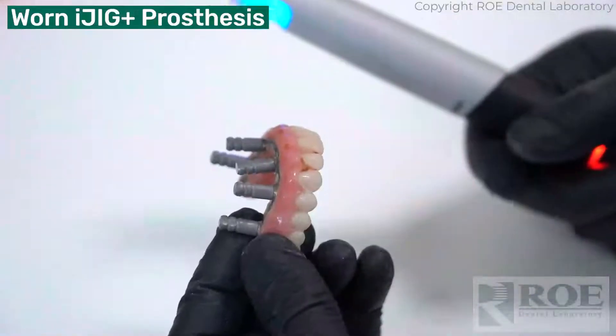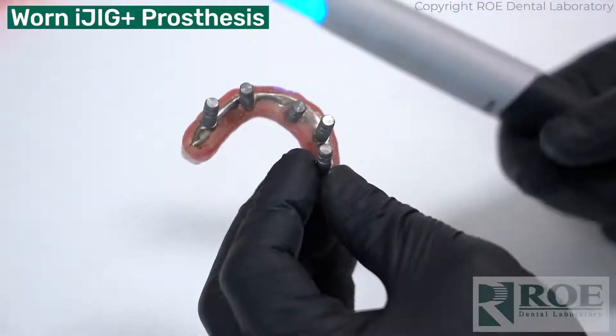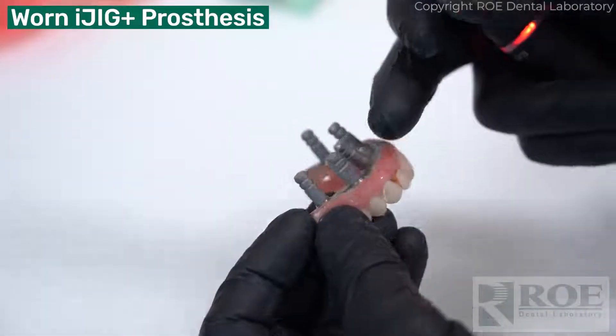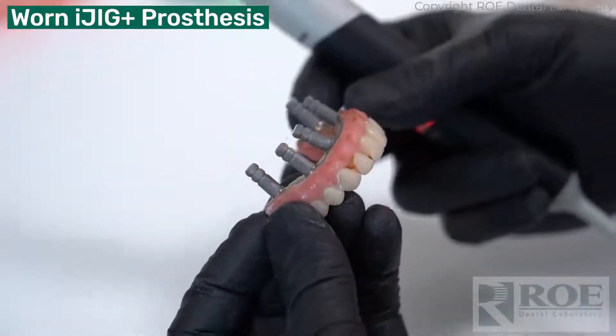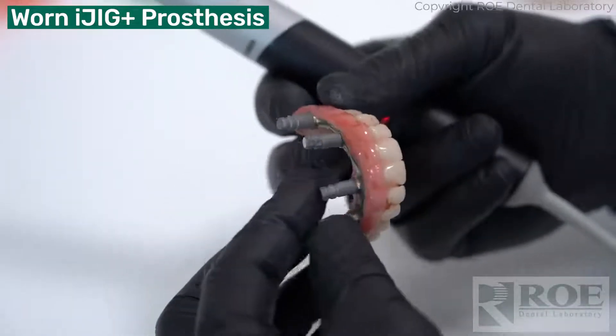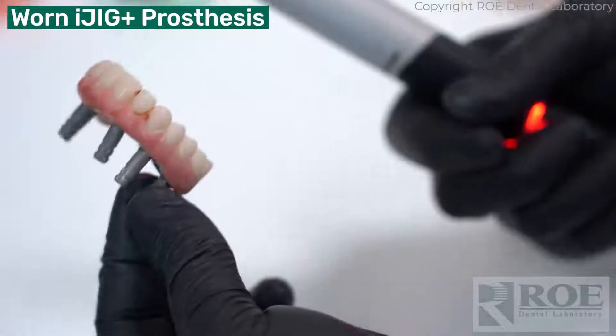Let's see how this scanner does with an iJig scan. This is a prosthetic a patient's been wearing — it's time for a new one. We just screwed in our multi-unit analogs, nice and tight, real firm. And then we simply hold it on our fingers and scan it.